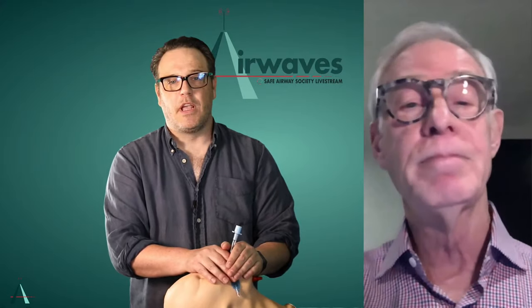Yeah. The advantage of that is that you have no other thing to watch other than the insertion of the endotracheal tube. A second advantage is that it forces you to watch the insertion of the tube past the soft tissue. So you're less likely to have any kind of an injury if you're otherwise distracted from watching the screen.